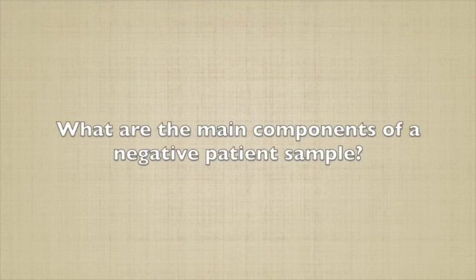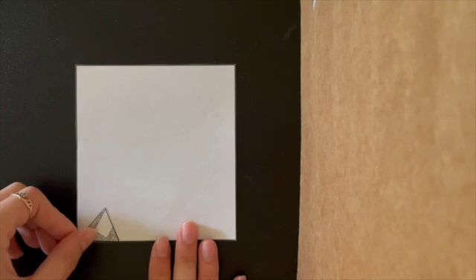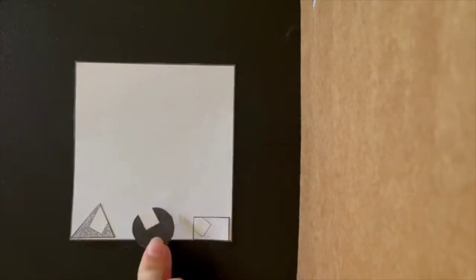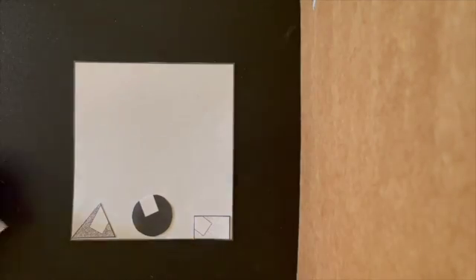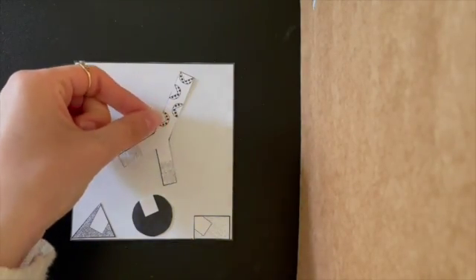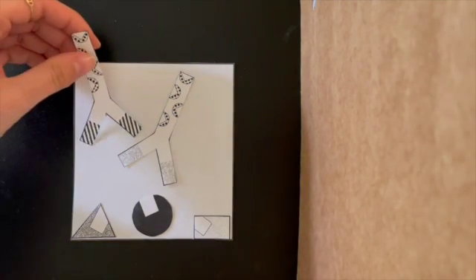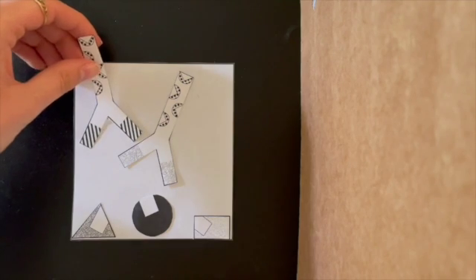In contrast to a positive control, a negative patient sample will have the incorrect antigens present where no binding between the primary antibody and target antigen occurs. The process begins by showing the addition of antigens to the designated well. Then, as seen before, the primary antibodies are added to the well where it has the ability to interact and bind to its specific antigen.